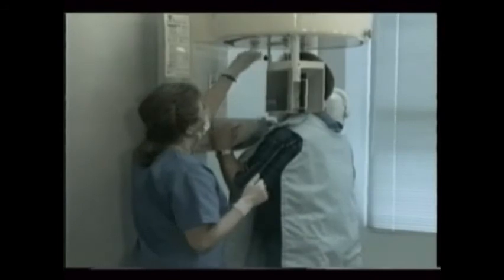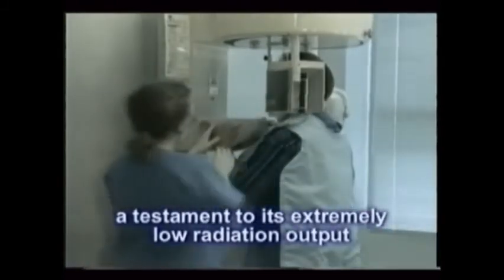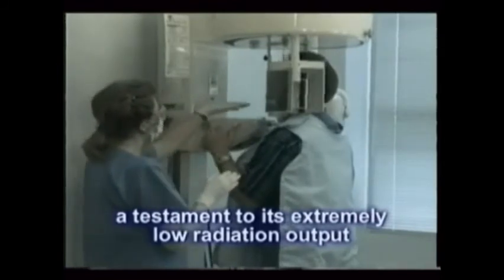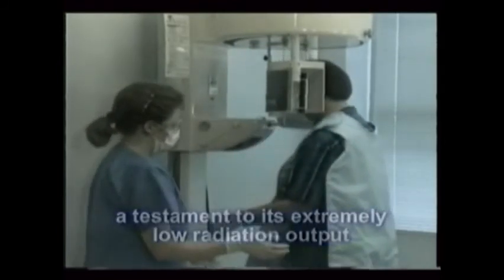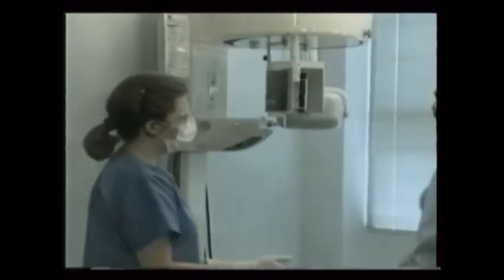You may eventually notice that panoral x-ray machines are often placed in high-traffic areas. This is perfectly acceptable — a testament to its extremely low radiation output. In fact, there's even no need to interrupt traffic flow by a machine that's in operation. Scatter x-ray levels are essentially non-existent.